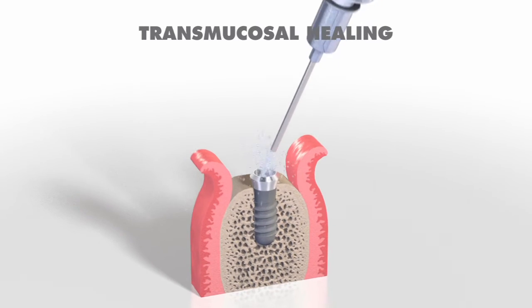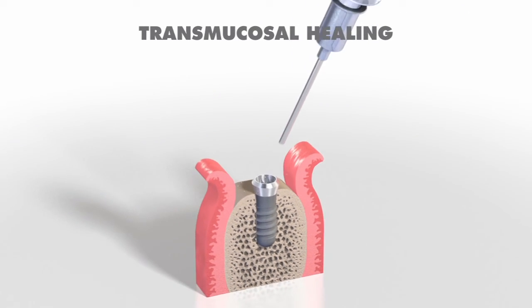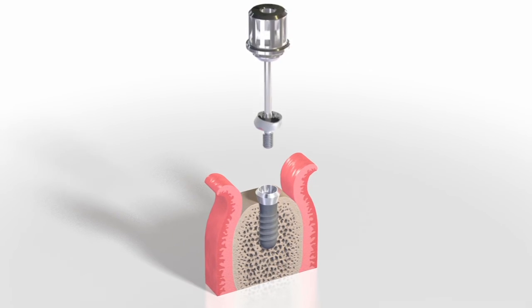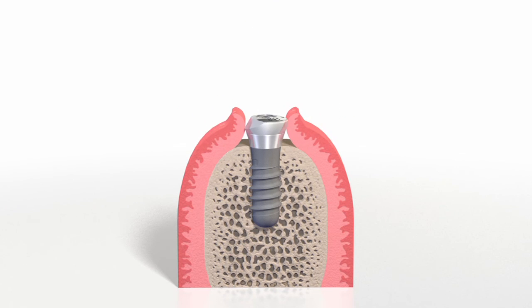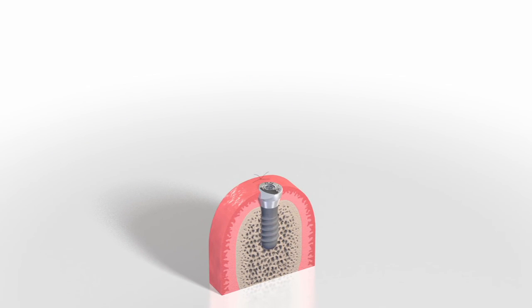Before mounting a healing abutment, the internal configuration of the implant must be clean and bloodless. The abutment is mounted using the SCS screwdriver. The friction fit secures the components to the screwdriver during insertion for safe handling. The healing abutment is tightened by hand. The soft tissue is adapted and resutured tightly around the abutment.